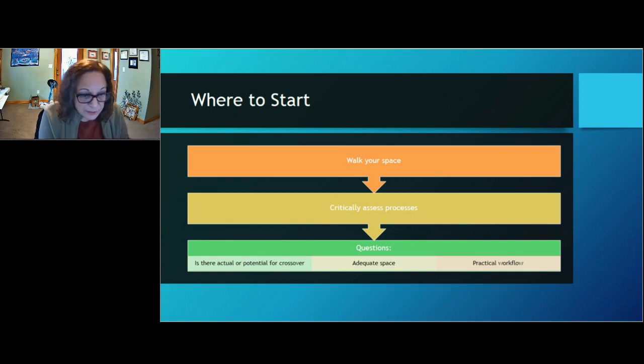Watch someone process instruments. Now, if you're not comfortable with that, or you think something's wrong but you're not really sure, you know, I've been doing this here for 15 years, I'm just used to it. Great. Do you have a brand new person at your practice? Preferably somebody who's worked elsewhere, perhaps?